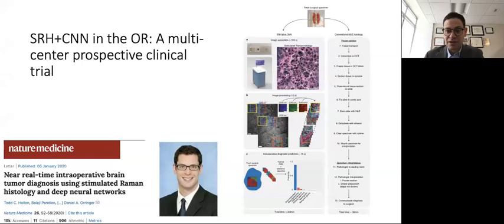Armed with a CNN that appeared to perform well on validation and test sets, we set out to execute a prospective multi-institutional trial to see how it could perform in an OR. Our workflow for the trial was as shown above. We tested the CNN on our images acquired from 3 SRH imagers deployed at 3 institutions across the country. Notably, the images from each center were indistinguishable to pathology reviewers. The lack of dependence on a specific processing, sectioning, or staining technique enabled this remarkable degree of consistency across centers.